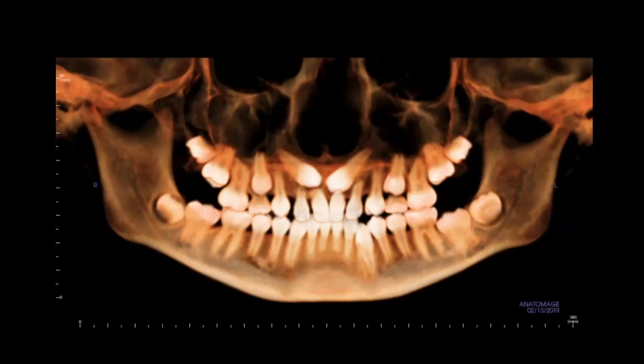Okay, so we have Pontics on the wire. We've got the canines exposed and bonded. I'm assuming with a chain or something, okay. So we got the canines exposed, bonded, chain. We have Pontics on the wires. The canines are in the middle. All right, so now what are we doing?